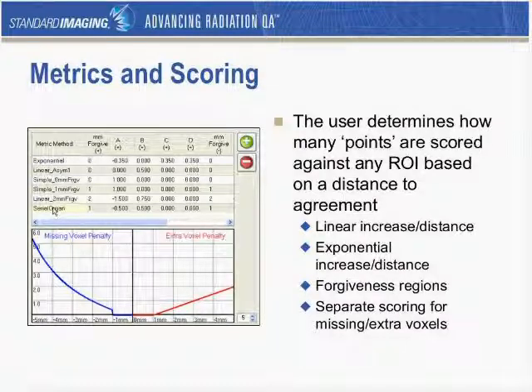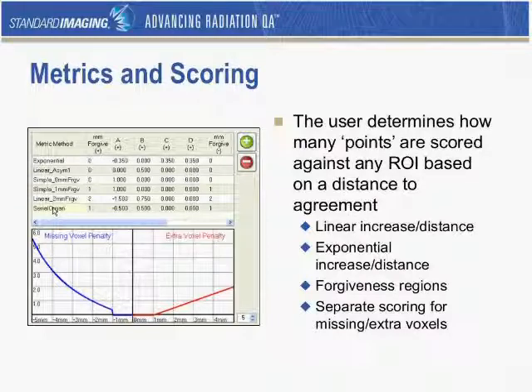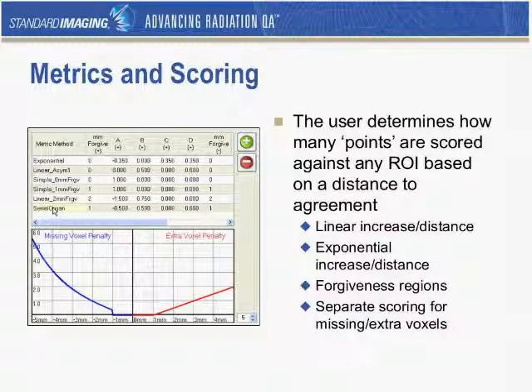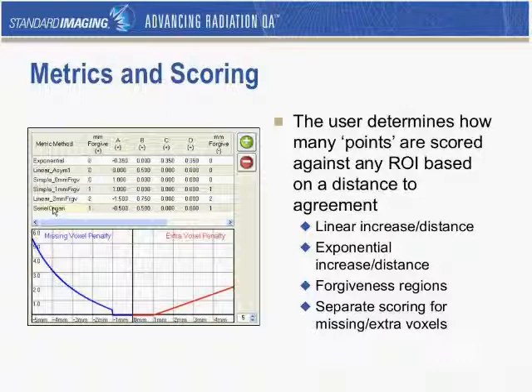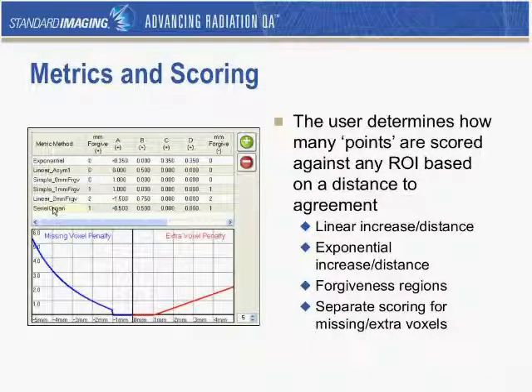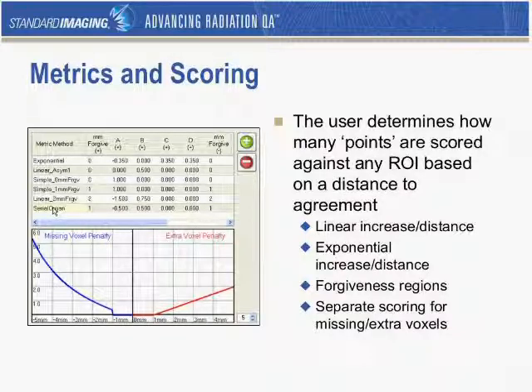The metrics are the key to the software. The user gets to determine how points get taken off for each ROI based on that distance to agreement. You can create metrics based on a linear penalty that increases strictly linearly on distance, or an exponential increase based on distance. You can put in forgiveness regions — so if you want to say anything within a millimeter is good to go, no points will be taken off. You can also have separate scoring for whether a voxel is missing or whether there is an extra voxel.